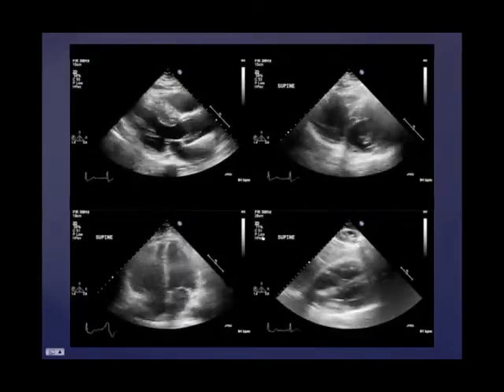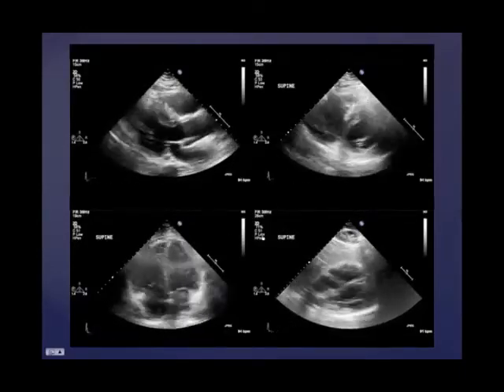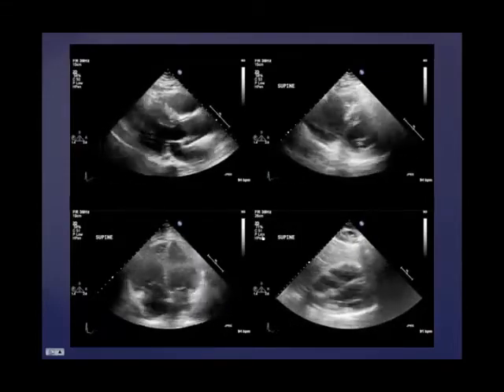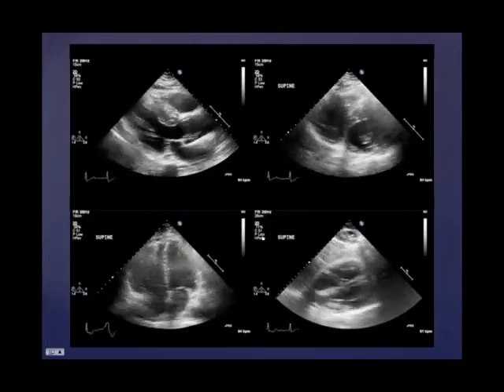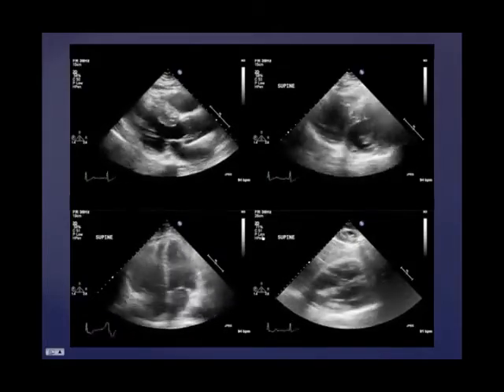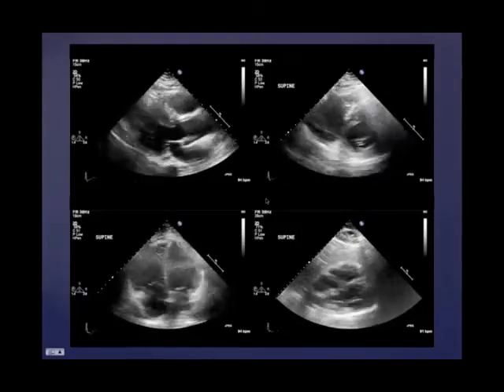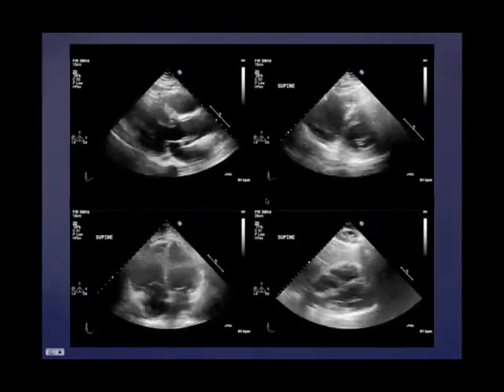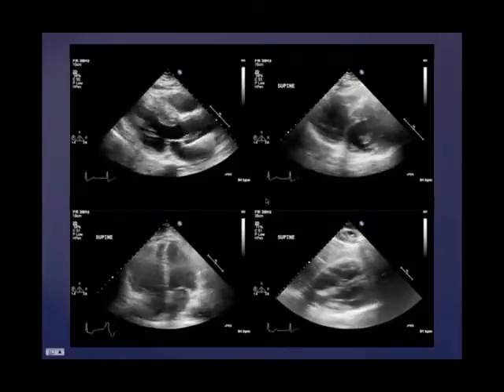And so if you've got a patient who's had a swollen leg and then has suddenly collapsed with hypotension, shortness of breath and hypoxia, this confirms that firstly it's definitely not hypovolemia. It's definitely not a tamponade. The LV is working relatively well. It's not a terrible LV. It's not hypovolemia, and it is likely to be a pulmonary embolism.